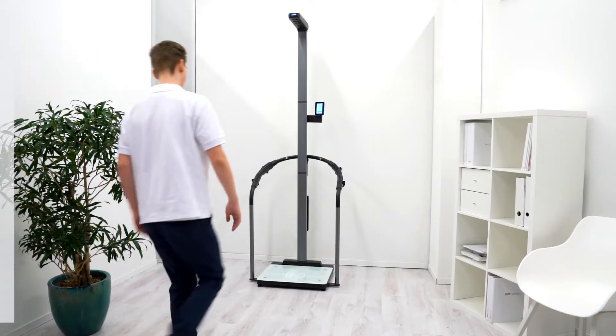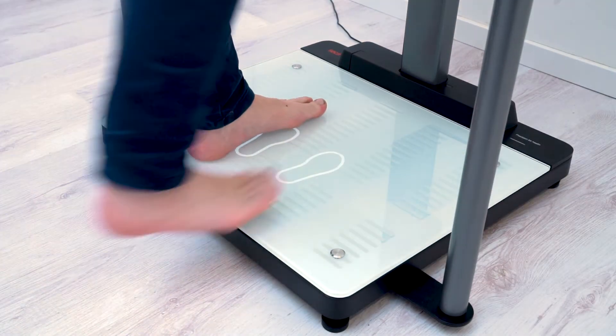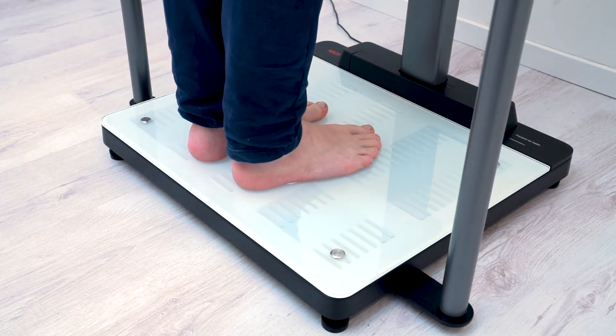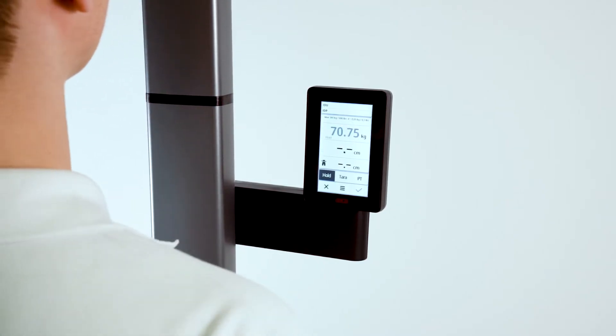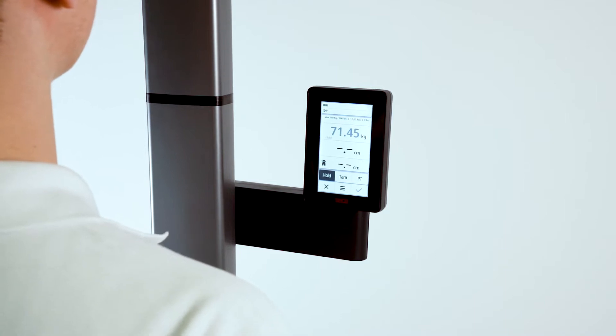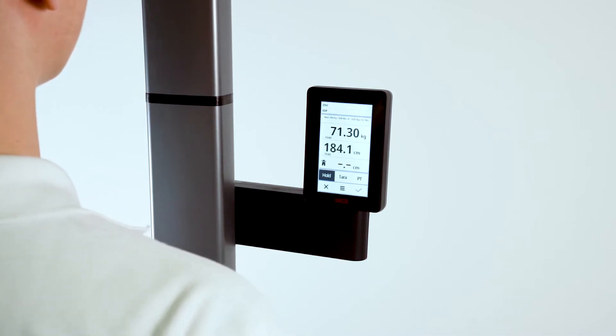Now that the device is set up, we want to make sure that you always get precise measurement results and that the safety of your patients and staff members is guaranteed. Please follow these instructions for placement and calibration.